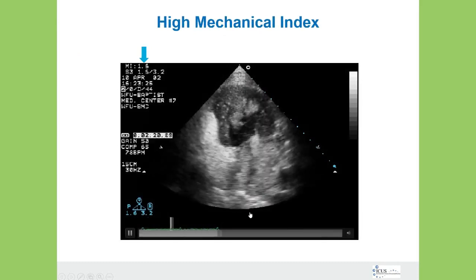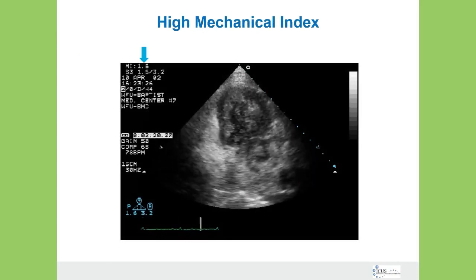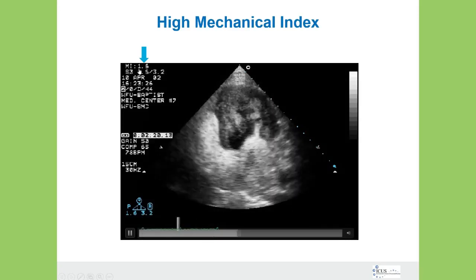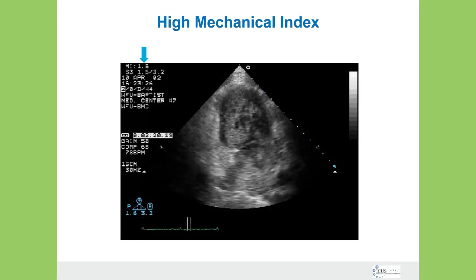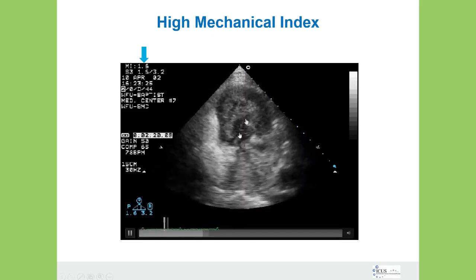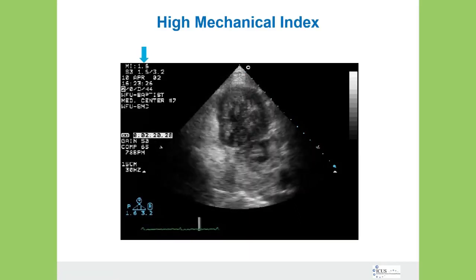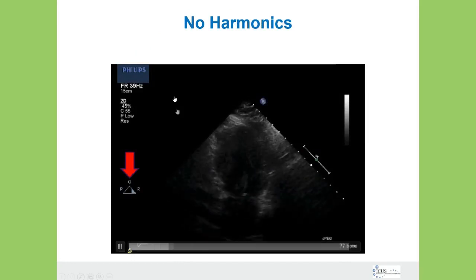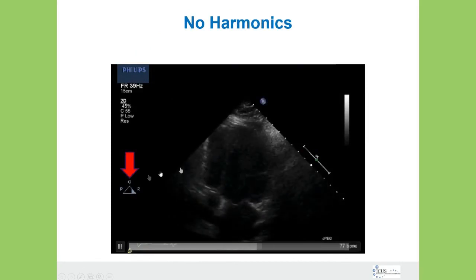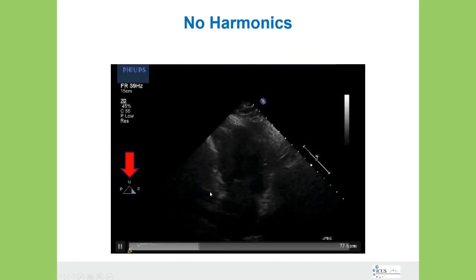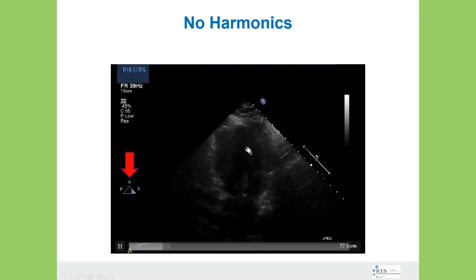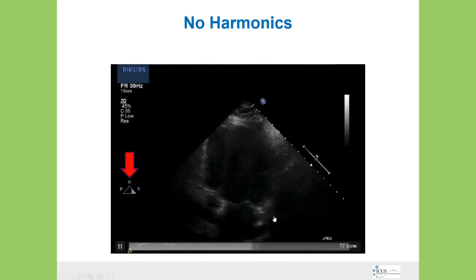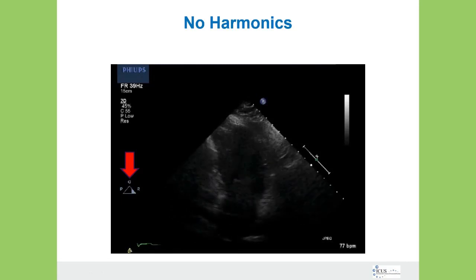Here's a patient we did many years ago where the sonographer did not go into the contrast preset. Looking up top, the mechanical index is 1.6 — that's what we usually use for unenhanced imaging. I can tell right away they weren't using the contrast preset. You can see there's not good filling of the left ventricle due to bubble destruction from the high mechanical index. In another example, there's very little contrast in the left ventricle and they're not using harmonics, which greatly helps visualization of contrast. This is kind of what we saw back in the Albunex days without second harmonics.